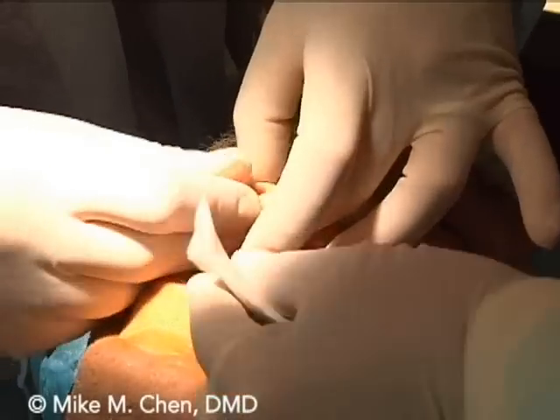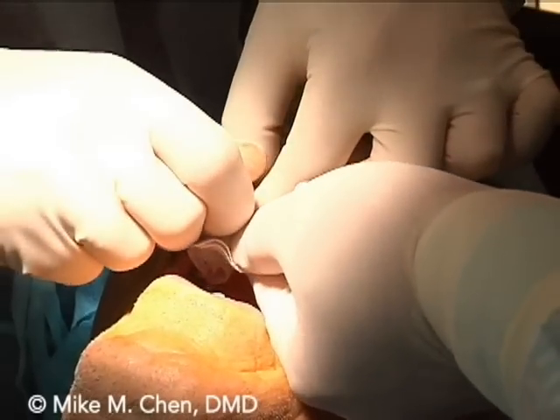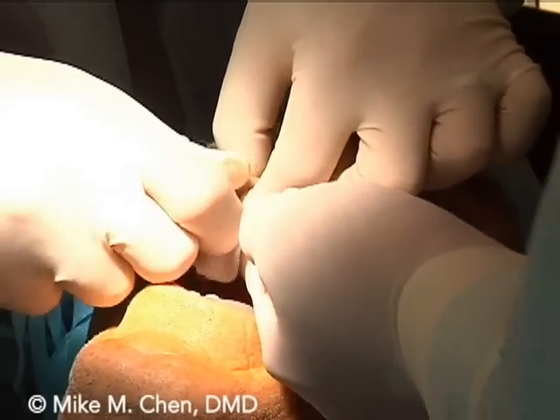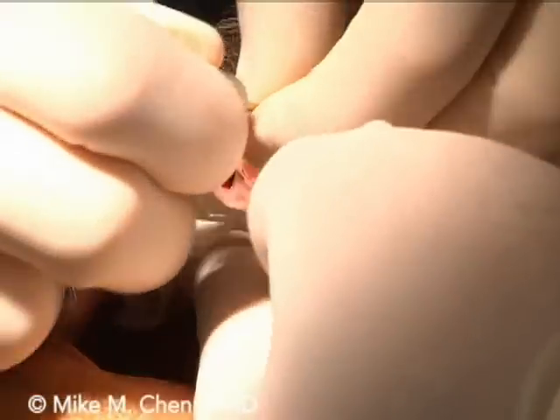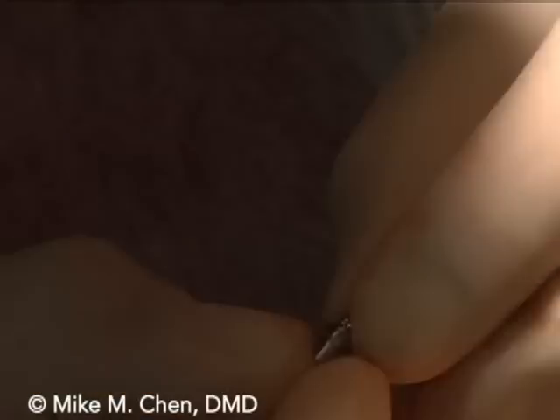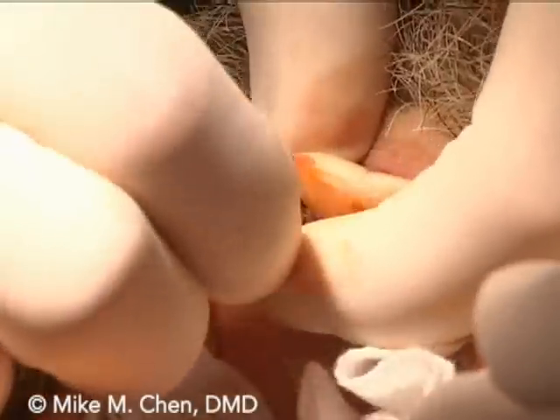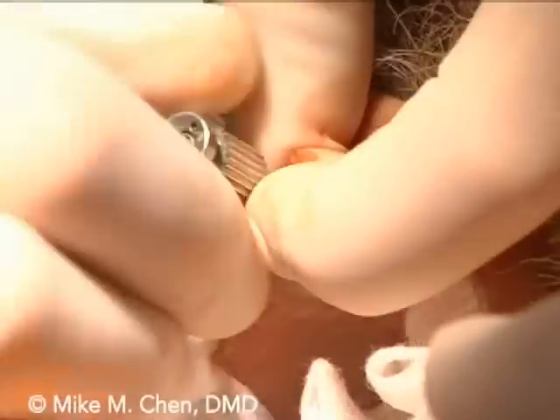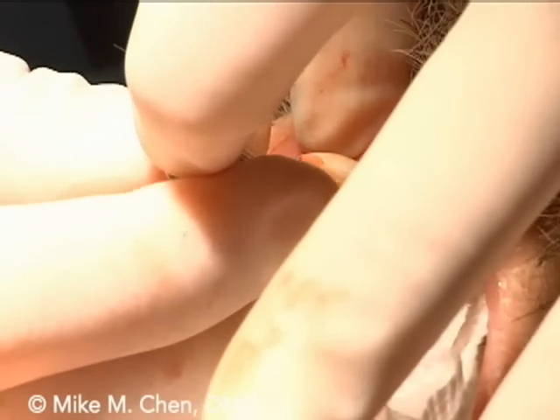And of course, now we'll remove the cover screw, and then we're going to place the abutment into the implant and also lock that down if we can, and then adjust the temporary. And what you see now is picking the right aesthetic abutment to use and then putting it down. And you can hand torque it to about 20 Newton centimeters, or if you want, you can torque it to 35 with the torque wrench. It's up to you.